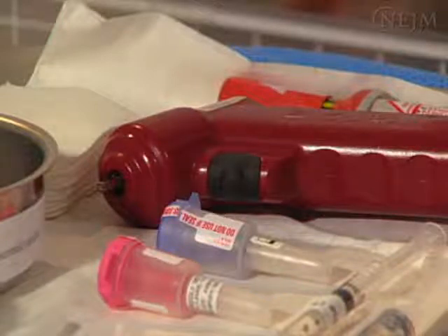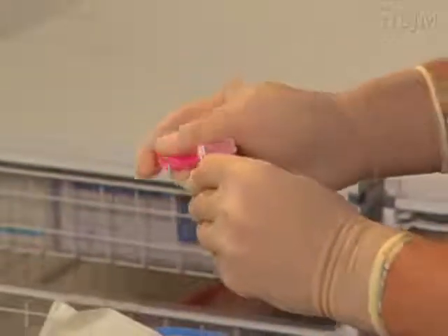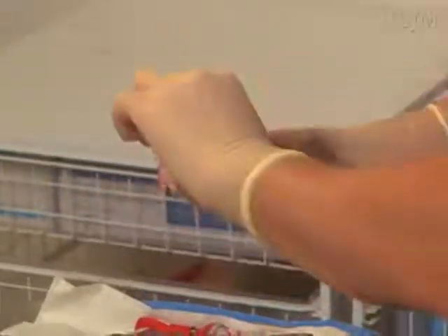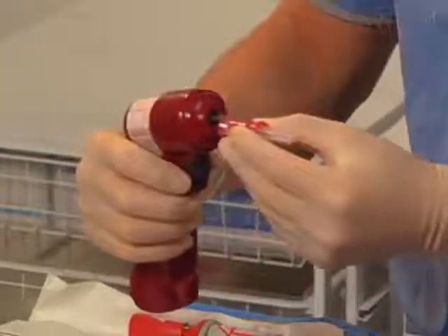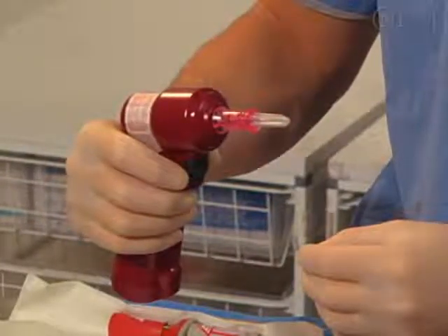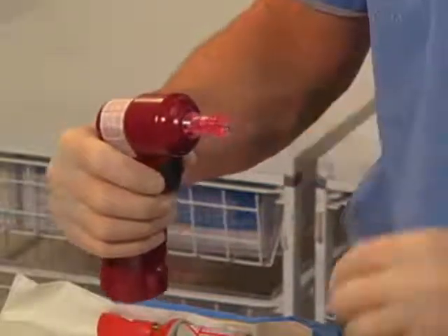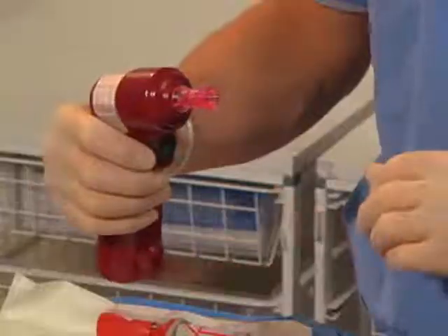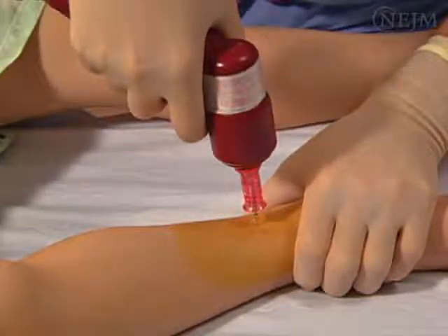Select the appropriate needle size based on the patient's weight. The pediatric needle is designed for use in children weighing less than 40 kilograms, unless large amounts of overlying soft tissue predict the need for a longer needle. Remove the needle from its protective container. Attach the needle set to the driver, allowing the magnetic pull to hold it in place. Turn the safety cap clockwise to remove it. Pull it off the needle. Place the needle against the skin overlying the site, 1 to 2 centimeters from the adjacent physis.